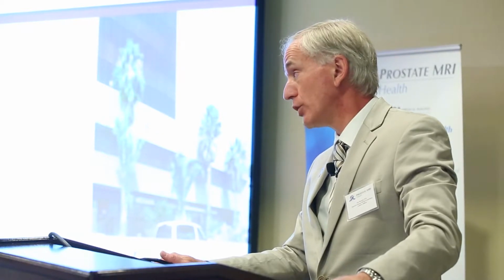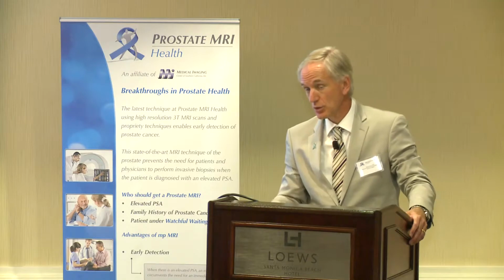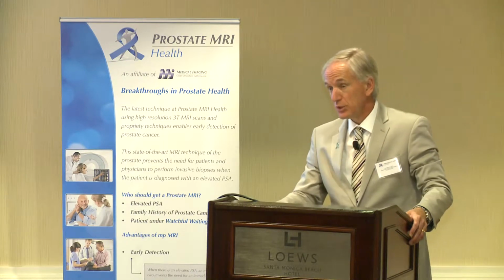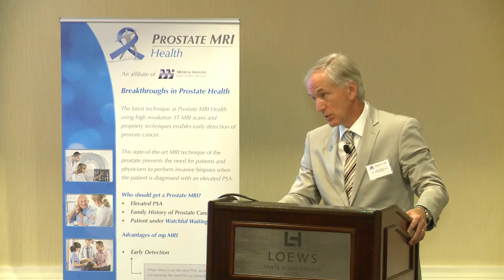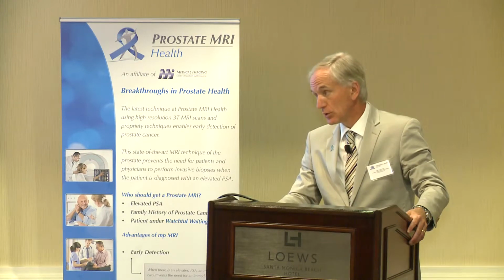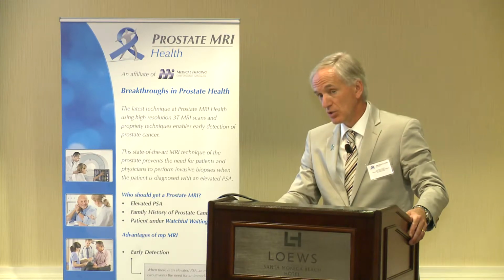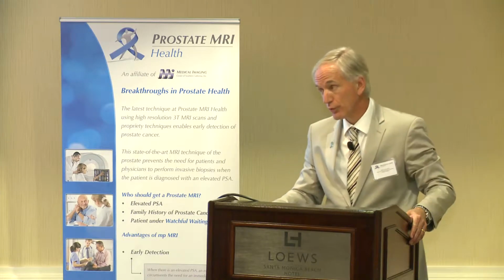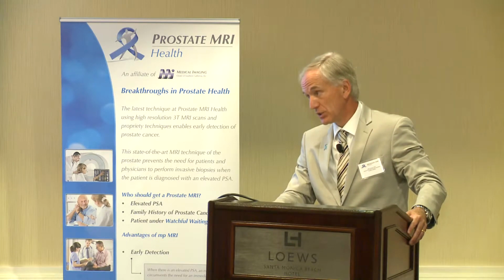We still have to learn. That's what we did with breast cancer. Based on the outcome, we can then perhaps do an MRI once in 2 years. But I would start with an annual MRI. It's just a 20-minute, 30-minute exam, and you'd rather detect a tumor in an early phase, when it's going to change from a 3+3 to a 3+4 or 4+3. So I would do it on a yearly basis.